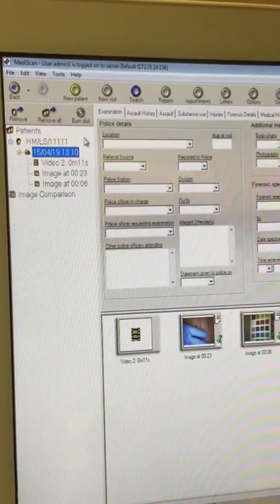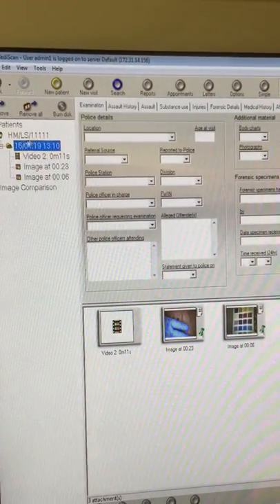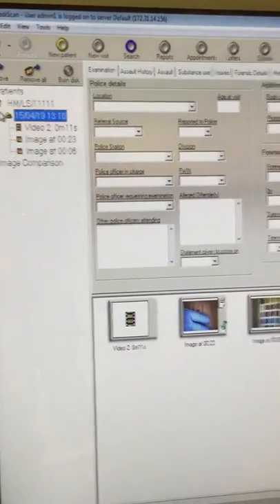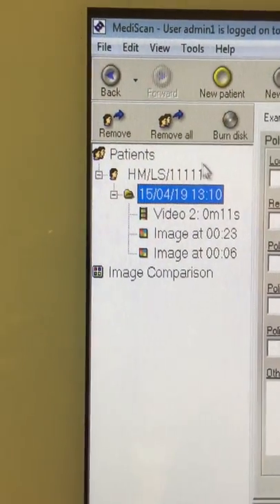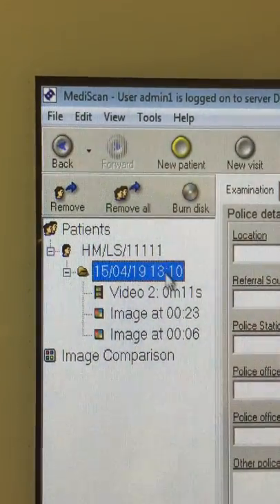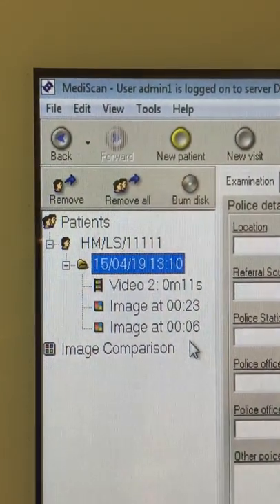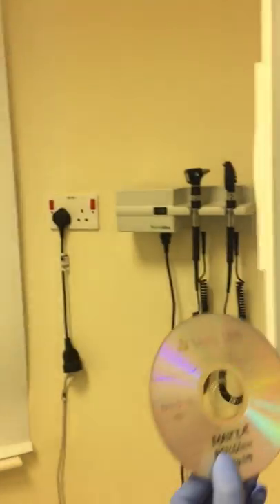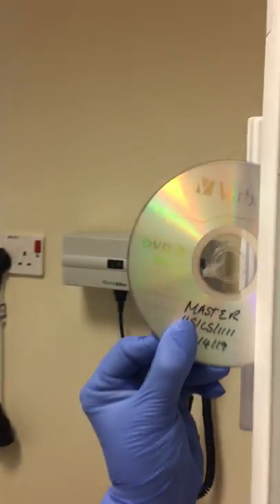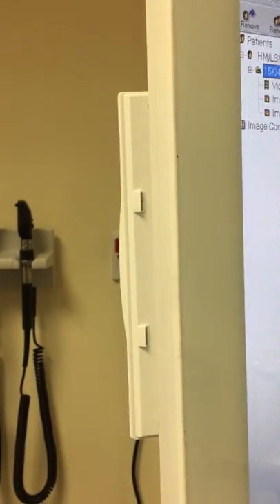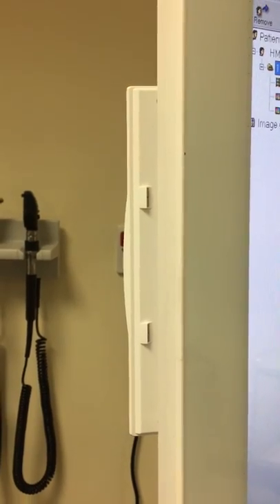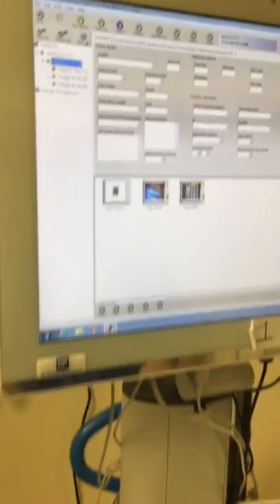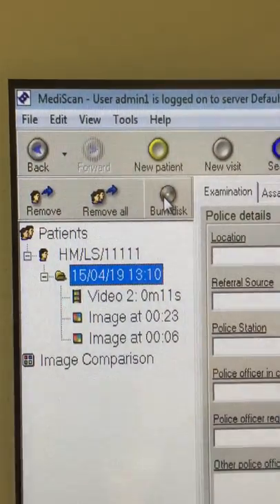You are on this screen. You have checked up here that you have got the correct client details and you are happy that these are the images you wish to burn, at which point you are going to insert the DVD into the DVD drive. On the colposcopes it's here on the back, and on the laptop it's on the side. We're going to insert the DVD and then we are simply on the screen going to click up here at the top, burn disc.